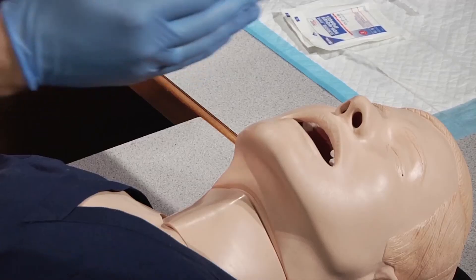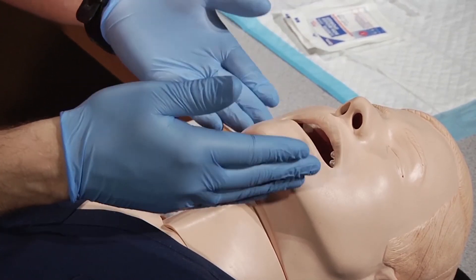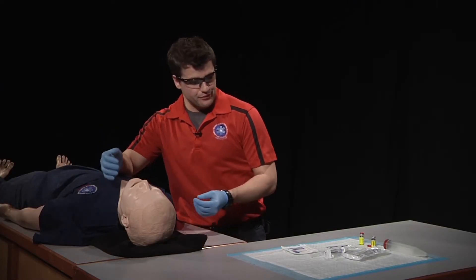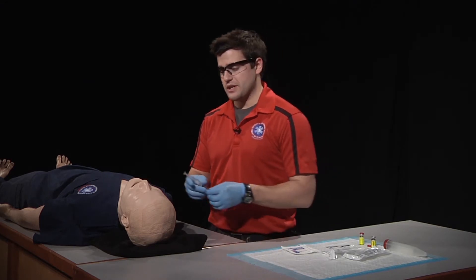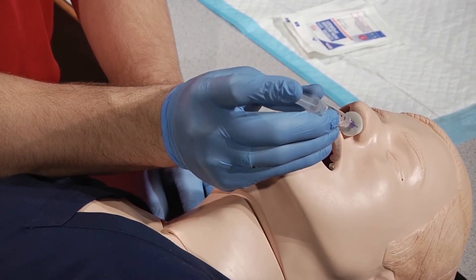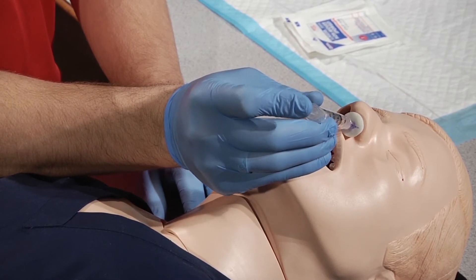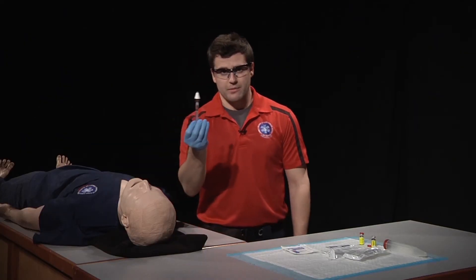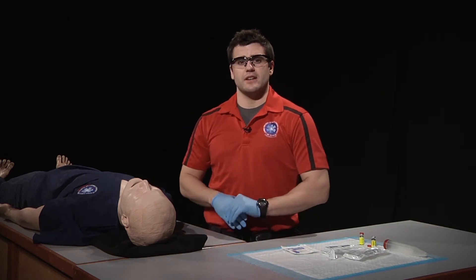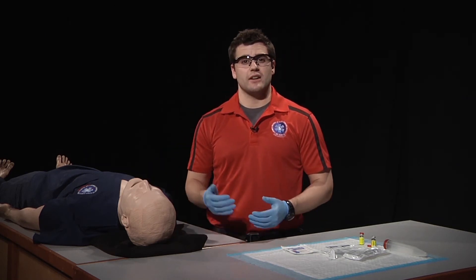From there, we're going to come over and inspect the nostrils, looking for the larger of the two, as well as the one that is least deviated and least obstructed. Once we've found that, we're going to insert the MAD into the nostril and briskly depress the syringe plunger. From there, we will dispose of the MAD appropriately, begin ventilations if necessary, and observe our patient for the desired and adverse effects.